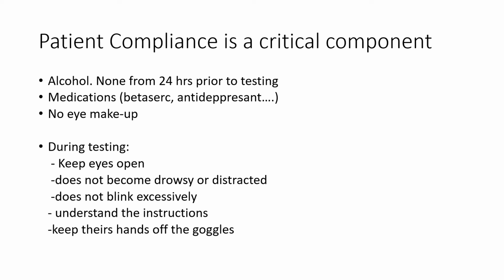And also we will ask them to avoid using eye makeup, such as mascara, because we want to prevent the infrared camera from misfocusing the pupils.